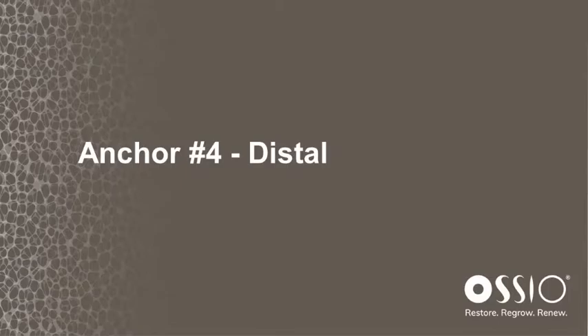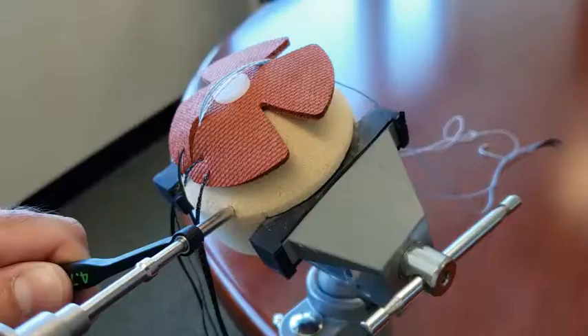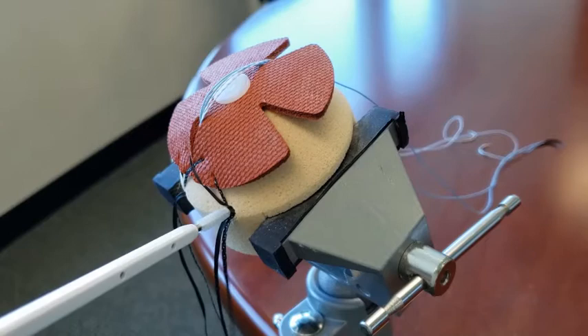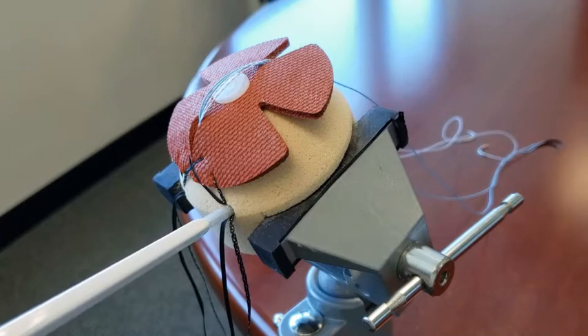The final distal anchor is placed in the same manner: drill and drill guide to the positive stop, snare, place the eyelet into the pilot hole, mallet the anchor into place making sure the first couple of threads are engaged. Turn the knob and thread the anchor into place until the distal end of the inserter reaches the surface of the bone.